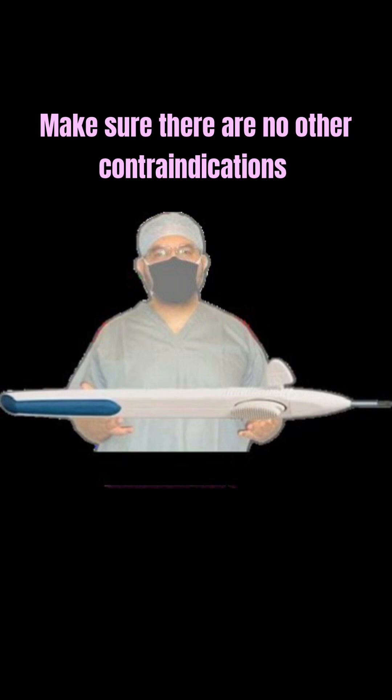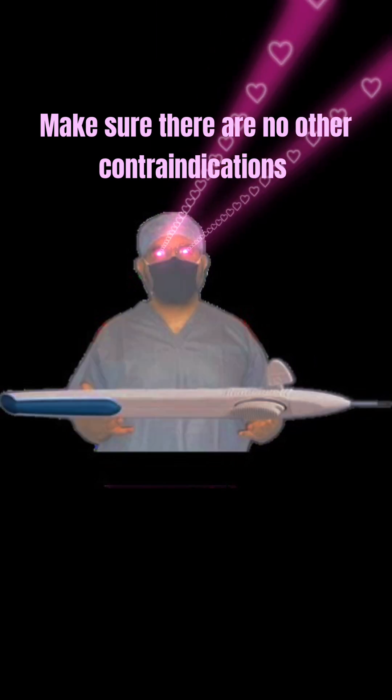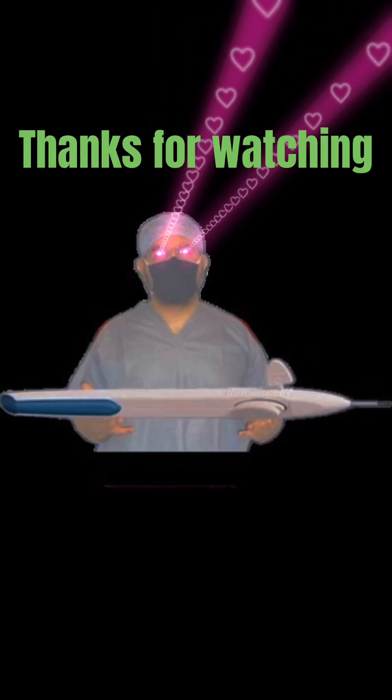Do not inject unless there is an intact posterior capsule of the lens. Make sure there are no other contraindications.